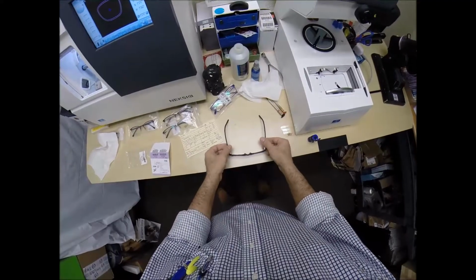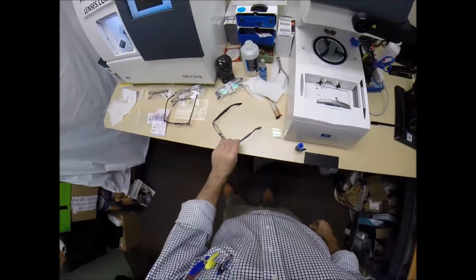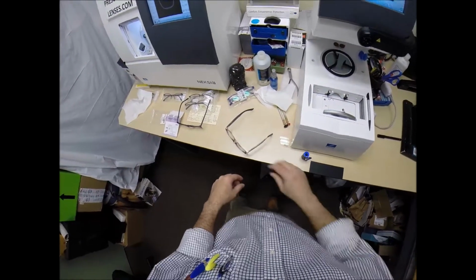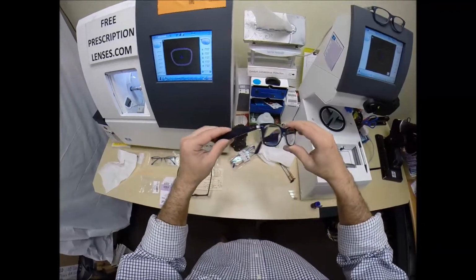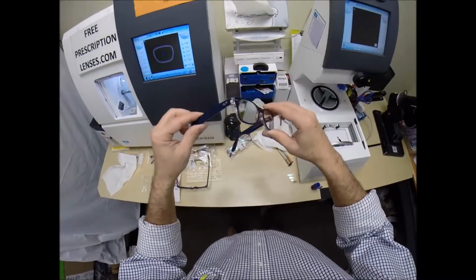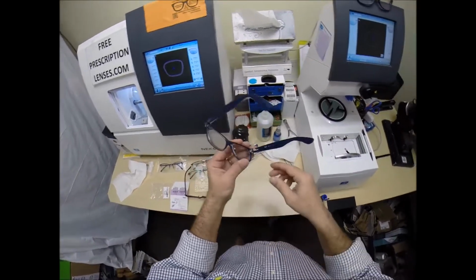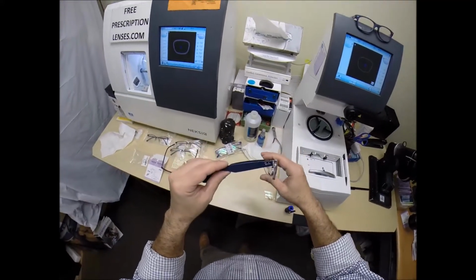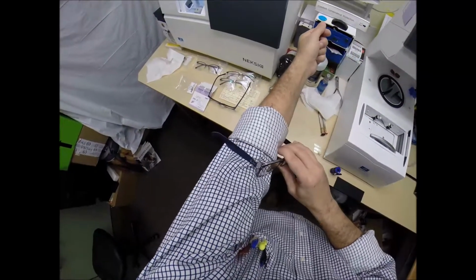I set them on the counter and press down. There is no wobble. When I say wobble, I'm part of that 80% where when I take mine off, they wobble on the counter, but they sit level on me. For those of you keeping score at home, I'm wearing the Ray-Ban 2132 New Wayfarer sunglasses, where I took the dark lenses out and put my prescription lenses in there. This is model number 2132, color 6053, blue crystal, so I can always be matching with my blue crystal.